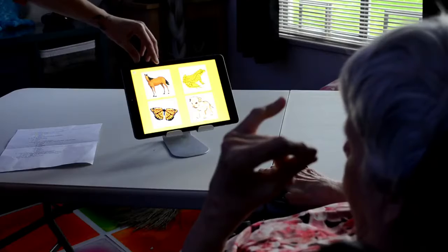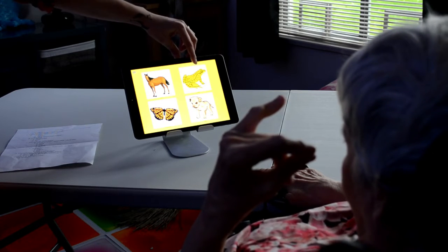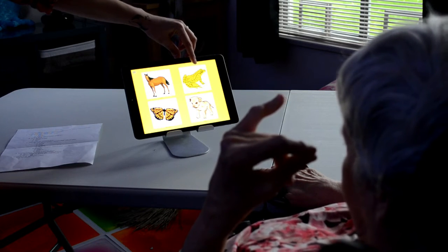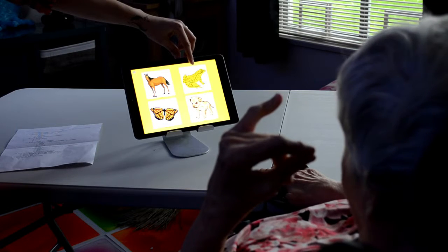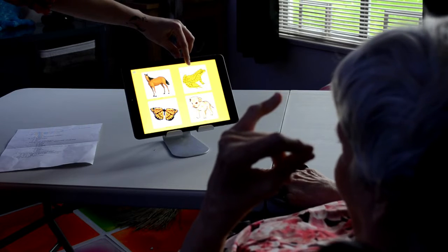And what I loved about this particular device was that it worked with a wide range of apps. It's so malleable in the ways you can use it and modify it that we could potentially use it for individuals with aphasia. We can use it for people with visual impairments. We can use it for people who have limited verbal communication. And it's really uninvasive when you look at a lot of the other devices that you need to carry around with you. It fits on one hand.